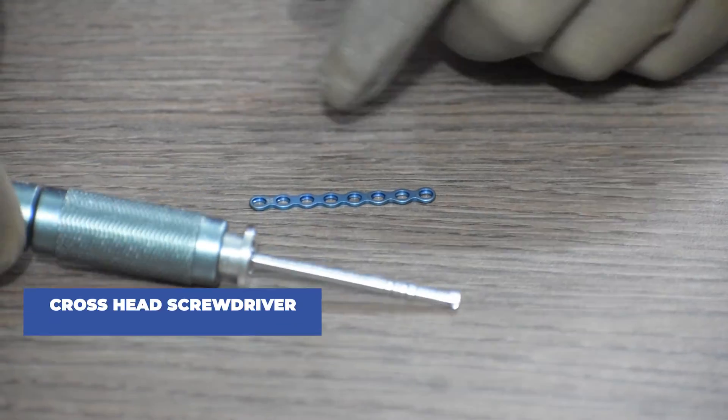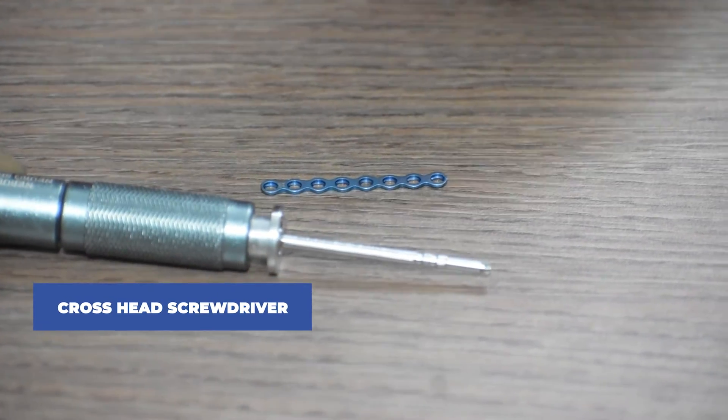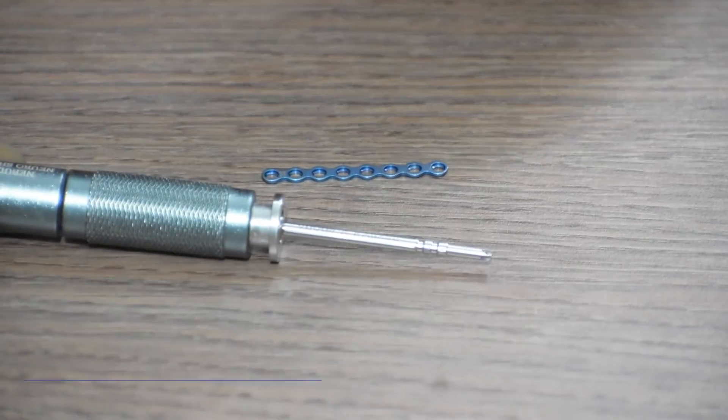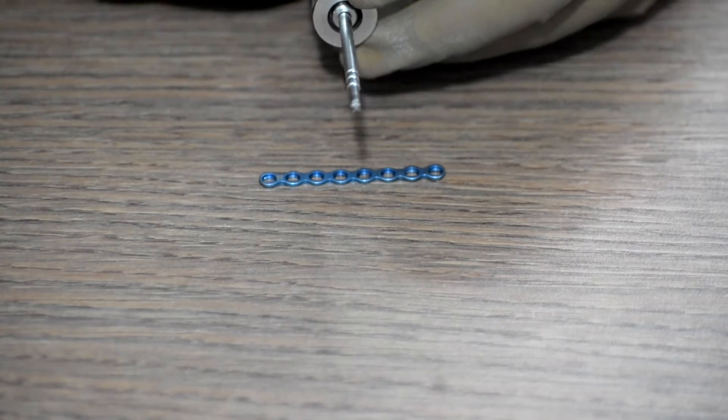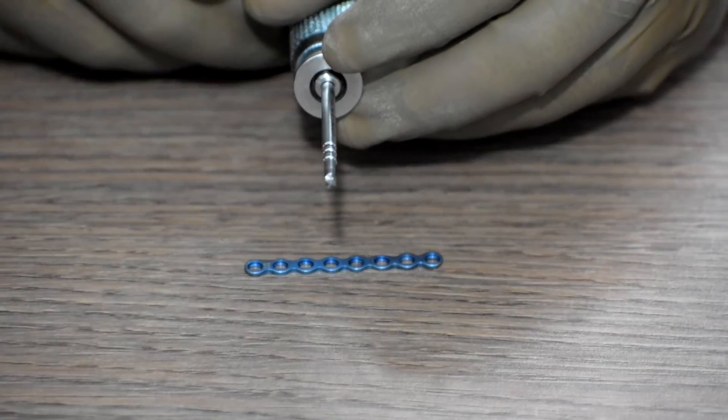After that, we take a cross-headed screwdriver. As you can see, this is a cross-headed screwdriver here.